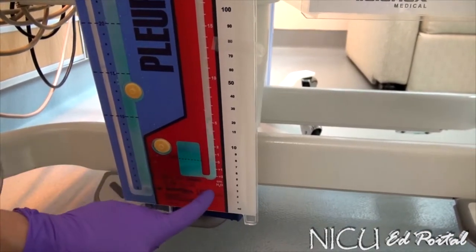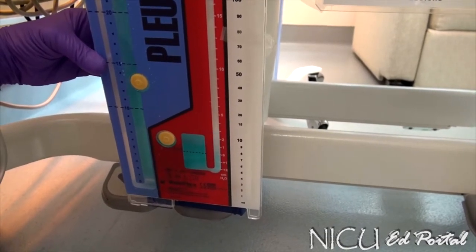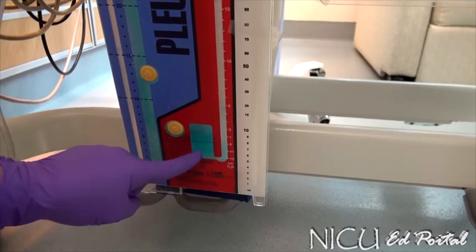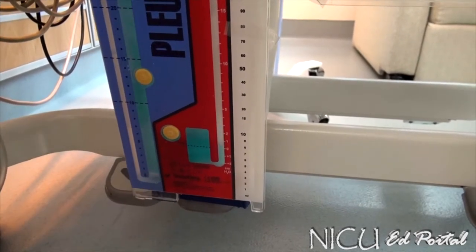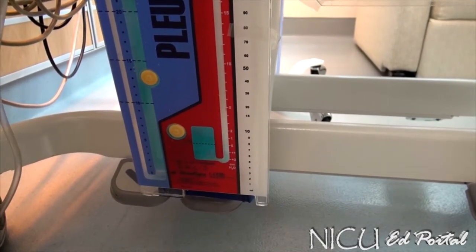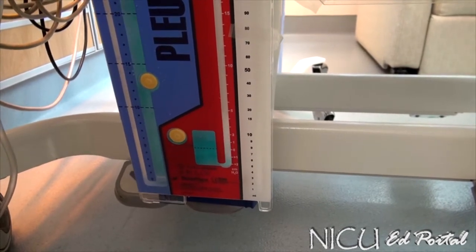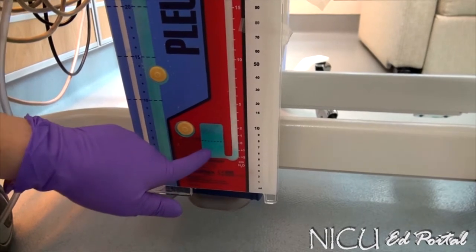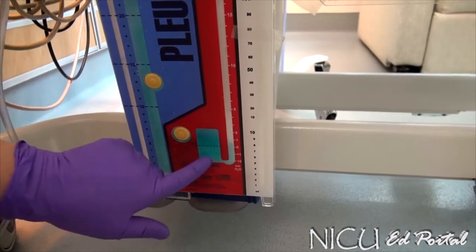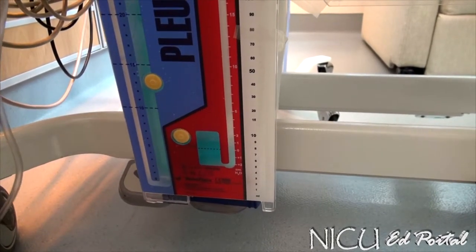You're going to see some residual bubbling, but if you notice this side here is still — that indicates the pneumo is mostly resolved. If it's just starting to resolve, you may see quick little blurbs of air. Right now, this baby is mostly resolved pneumo. This suction control chamber is always bubbling; the water seal chamber, we hope, is not active once the evacuation and pneumo has resolved.